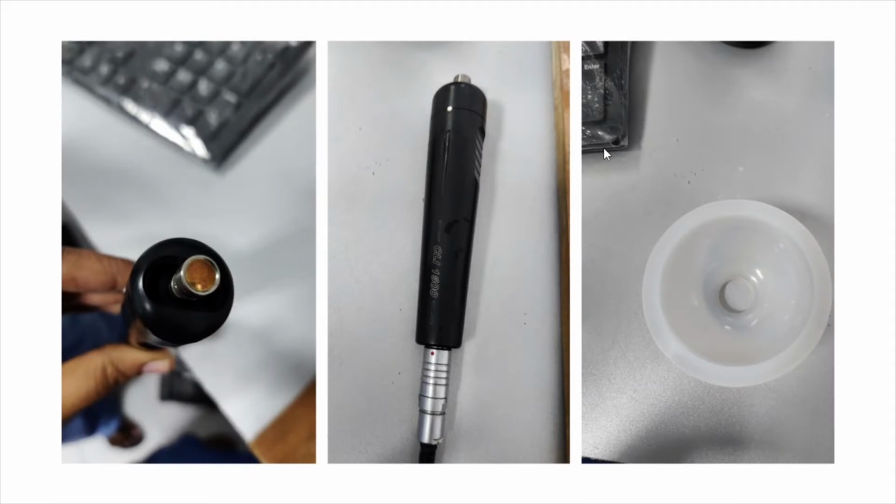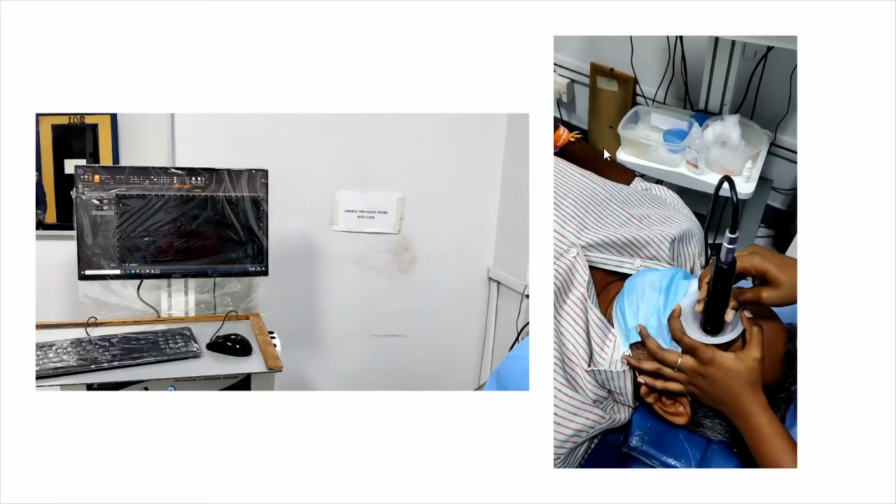This is an image of the eye cup and the transducer probe used. This image demonstrates how we are performing ultrasound biomicroscopy. The transducer probe is placed in the eye cup.